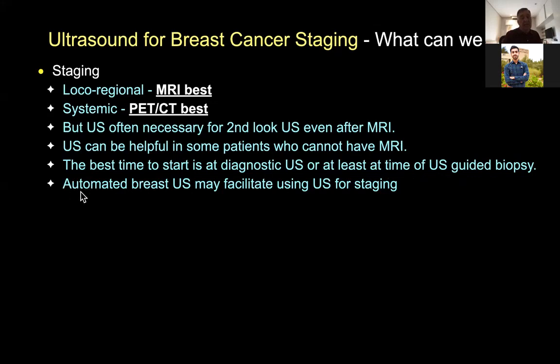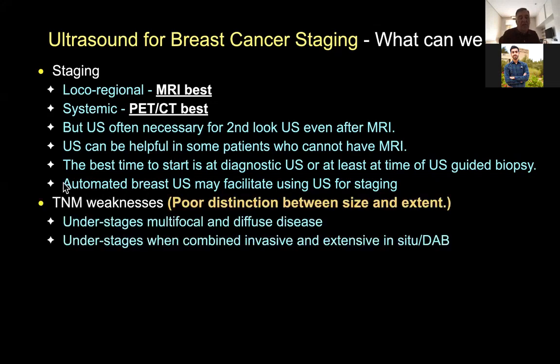And I will make a plug here that automated breast ultrasound may facilitate using ultrasound for staging. Everybody just talks about automated breast ultrasound for purposes of screening, but I think it can be very useful for staging. With some of the larger 15-centimeter probes, you may have to develop special techniques in order to adequately show the axillary lymph nodes, but I think it could be very useful.